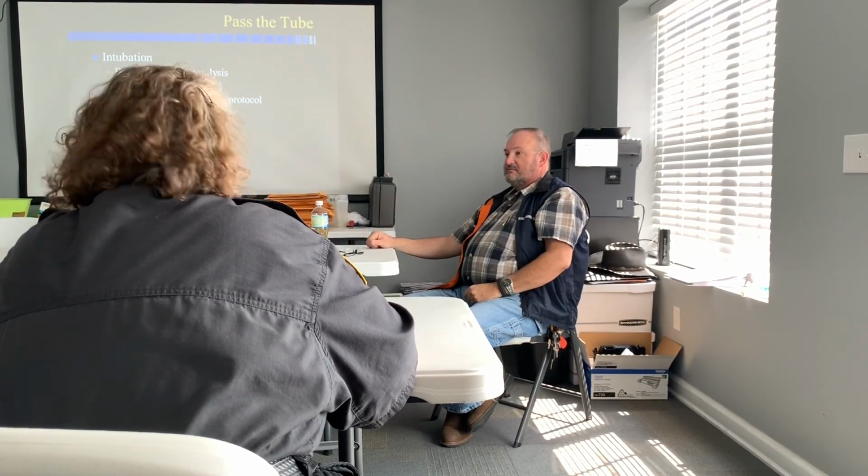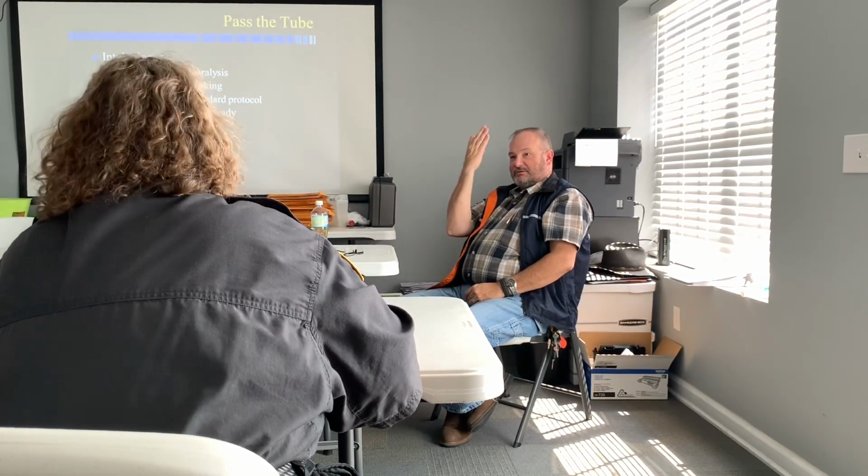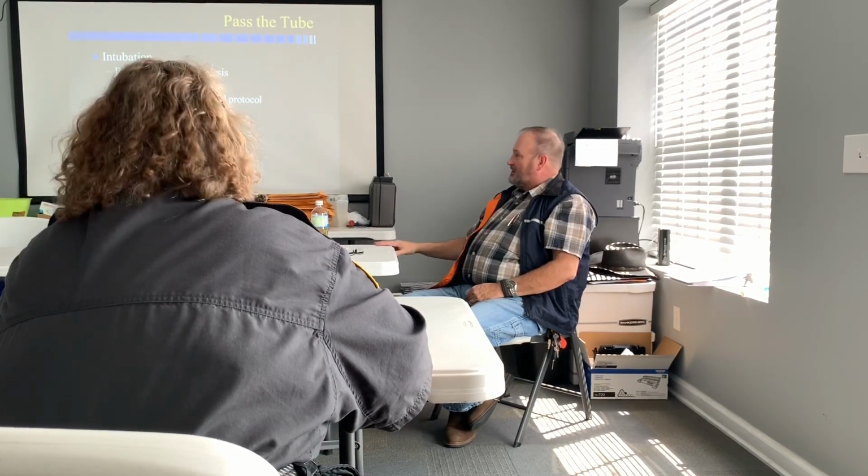What happens if you're not using sucks, if you're using ketamine? Well, you could do that, right? You could do the blink response too. Also, you can open his mouth. If you start introducing the blade and he takes it without gagging or without biting, he's good to go. I wouldn't use your finger, right? You'll do that once, right? Yeah, but you could try that too.